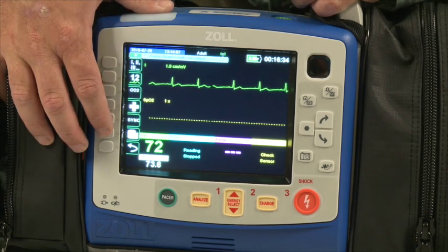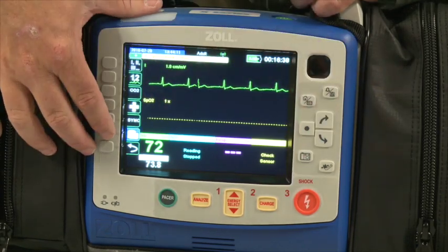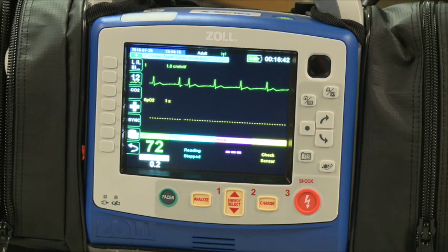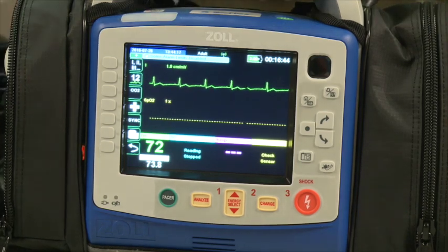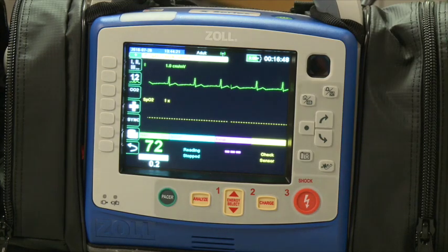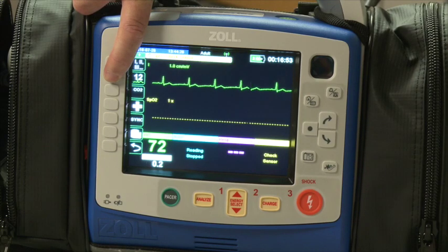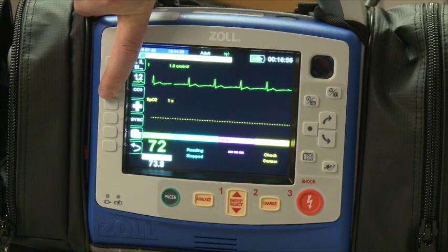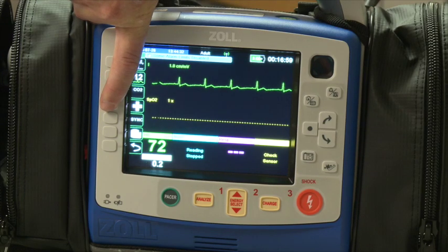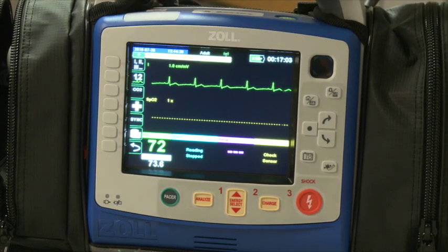Code markers are the next key down and are configurable. Currently they say oxygen, aspirin, morphine, and nitro. Pressing these buttons marks your strip — for example, if you gave oxygen at 9:02, it records that on the strip and gives a 10-second strip in case it changed the rhythm. You can program them to be anything in any order. There are two pages of code markers. The recorder key is an on-off switch — press to start, press to stop — versus the snapshot key which always gives a 24-second snapshot.